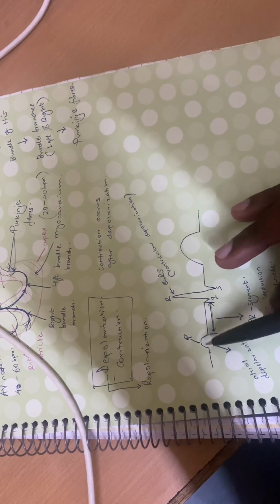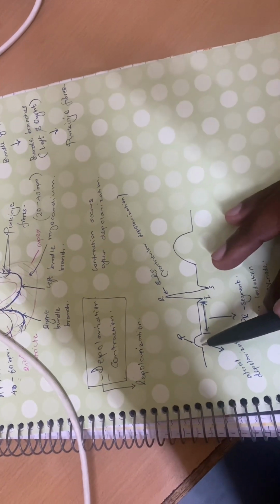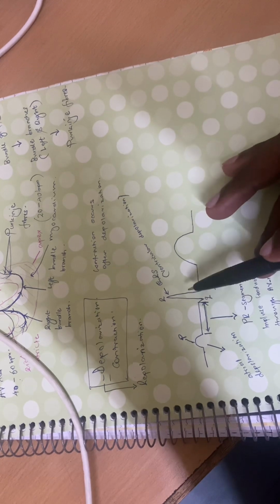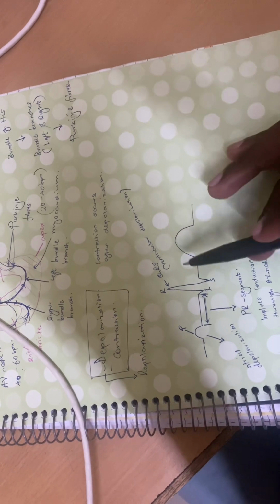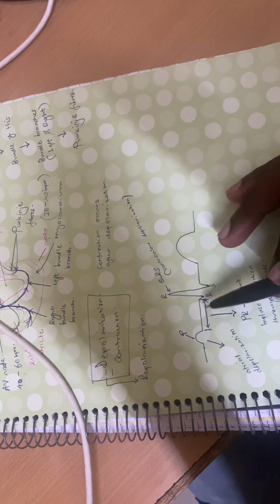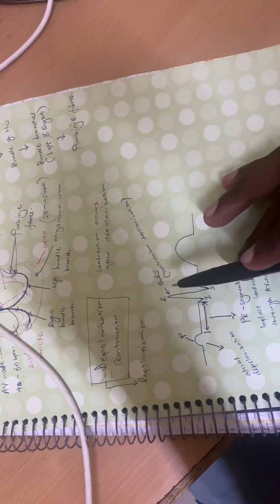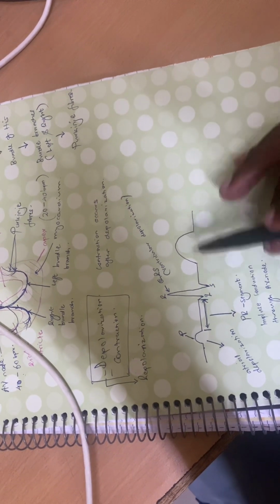Even here P is both atria at the same time. And this is the normal P. It has to be positive, I told you. Positive in all leads except AVR. QRS complex. Q can be there or may not be there. S may be there or may not be there. R may be there or may not be there. The most important thing is naming. The first negative wave after P is Q. The next positive wave after Q is R. And then the next negative wave after R is S.